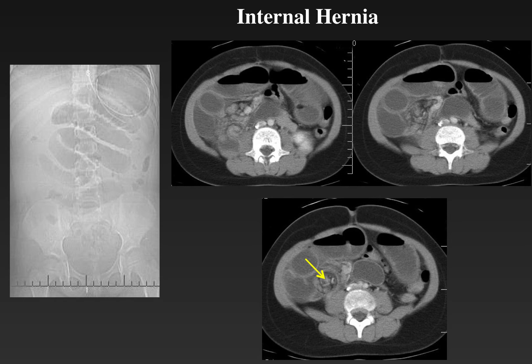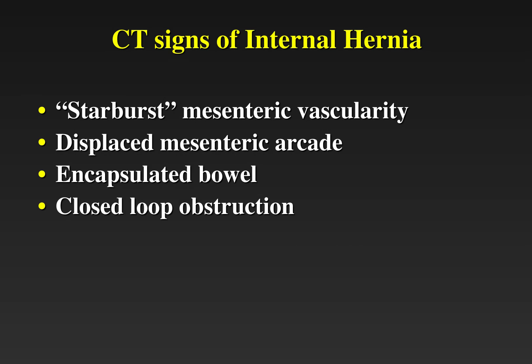On the plain film, we can see dilated stacked loops of small bowel representing the small bowel obstruction. The CT signs of internal hernia include the starburst appearance of mesenteric vascularity, a displaced mesenteric arcade to the side where the hernia occurs, encapsulated bowel, and closed-loop obstruction.